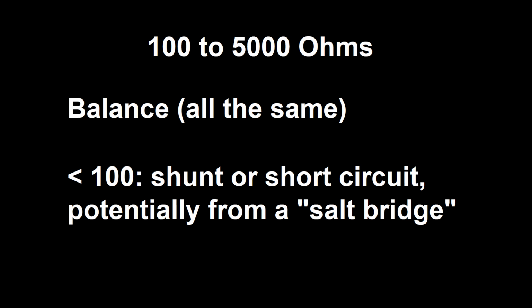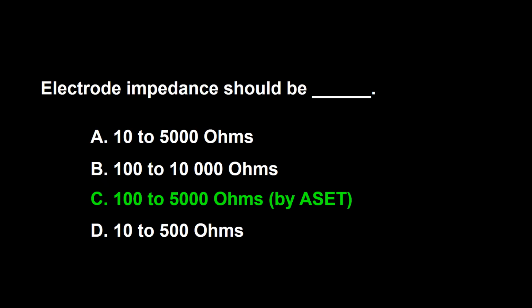It is also important, as recommended by other authors, that the inter-electrode impedance, that is the impedance between all the electrodes connected on the scalp, be within 1000 ohms of the others. The answer is C. Thank you.